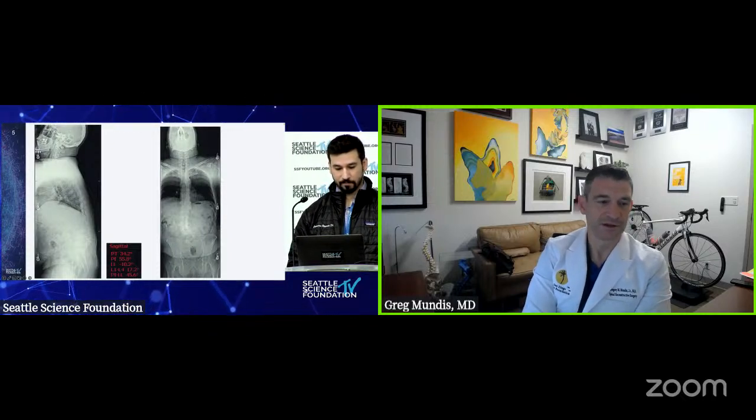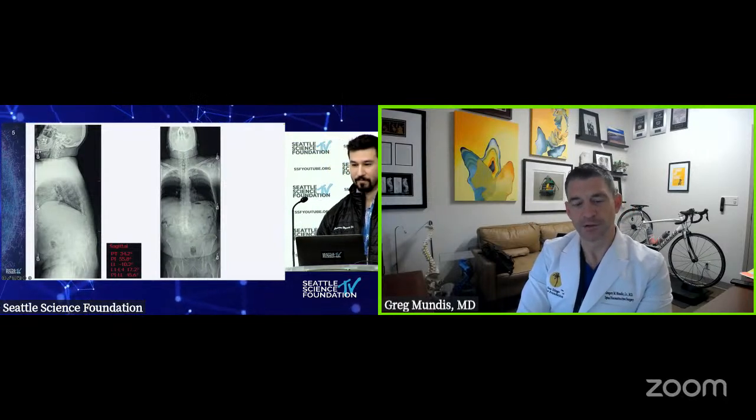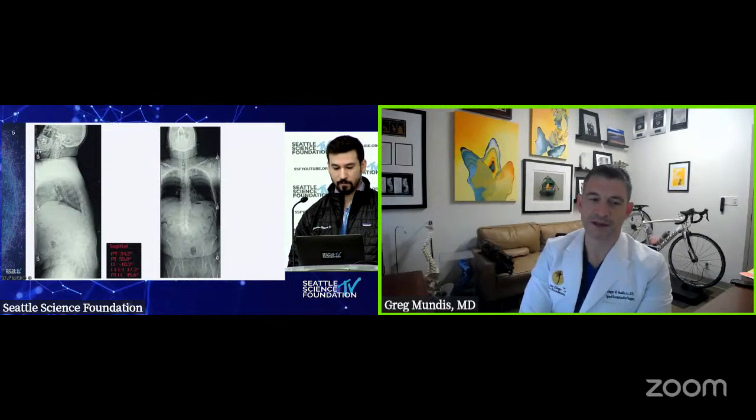I don't trust this guy's muscle tension. I don't trust his arthritis. I don't trust his bone quality. But I would certainly be prepared to go high on him. I don't think he needs a PSO or anything like that. He's got a lot of disc spaces that are open. L5-S1 has a decent amount of lordosis in it. His L4-S1 is short, but his main focal problem is at L3-4.